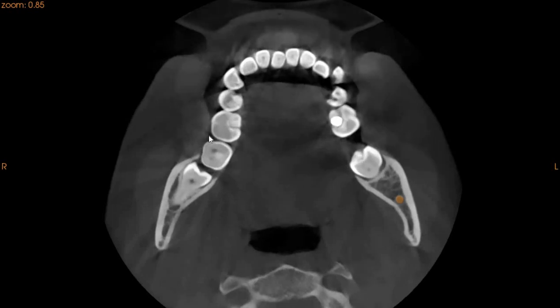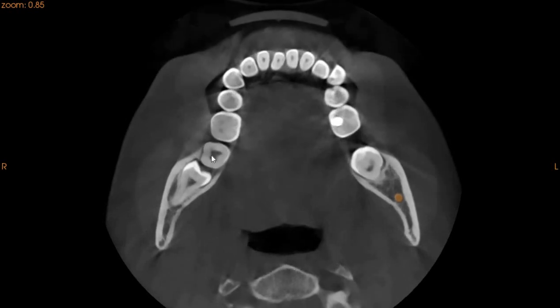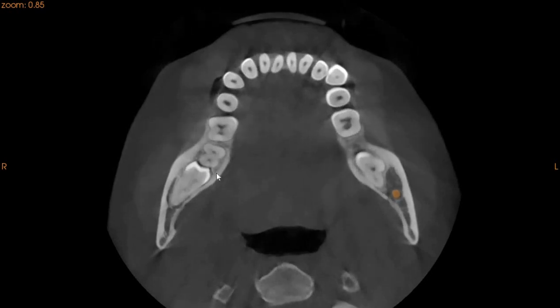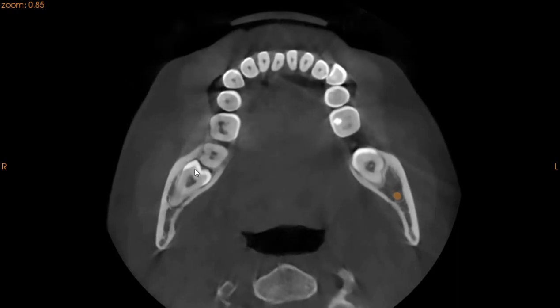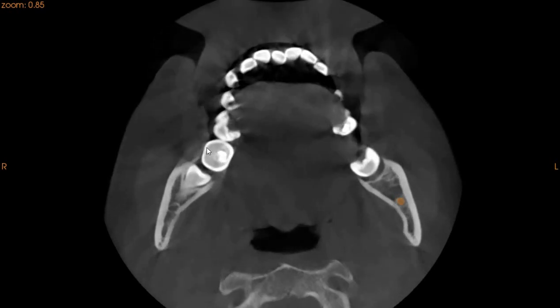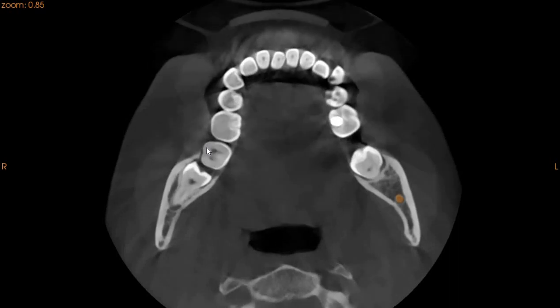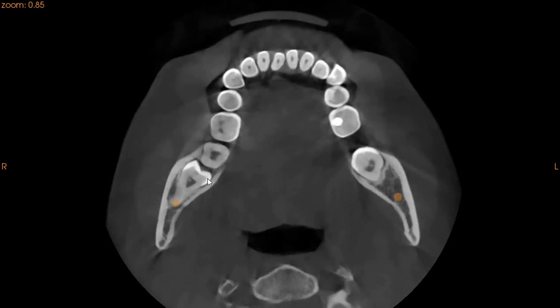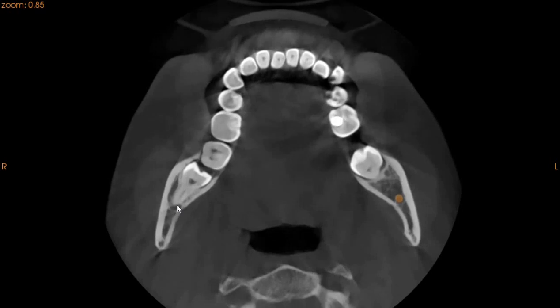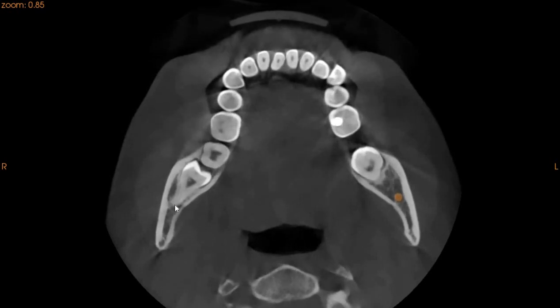Now this is the axial section — we're looking from top to bottom. This is the right-hand side, the 47 and the 48. Here you can see that the mesial cusp of the 48 is engaging into the roots of the 47, and this is a problem because the mesial cusp is below the crown of the 47. So during the extraction there is a very high likelihood that 47 will hinder the extraction, so this will need to be sectioned. Here you can see this is the nerve and this is where it gets compressed close to the apex.